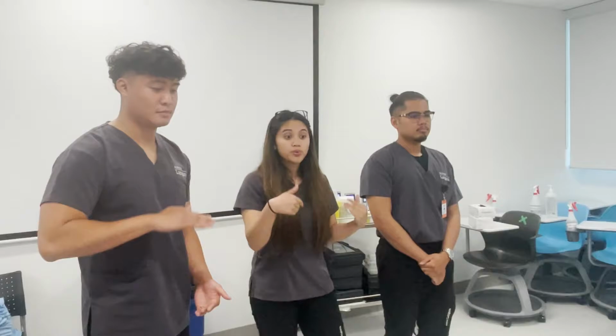So our 5 objectives today are that you'll be able to explain the mechanism of type 2 diabetes. You'll be able to identify at least 3 signs and symptoms of both high and low blood sugar. You're also going to perform a return demonstration to us showing that you know how to use the glucometer properly. And then we're going to see if you understand how to interpret your results from the glucometer and are able to list 3 lifestyle modifications, not just being able to take your glucose measurements, but what else you can do in your life to manage your diabetes, okay? And at the end of the session, we'll have a quick quiz to make sure you all feel 100% about the contents of the course.